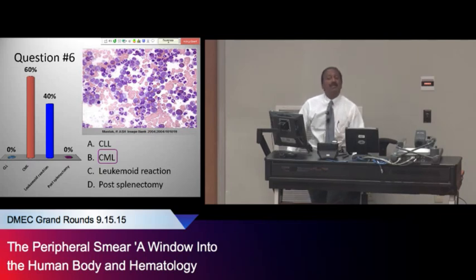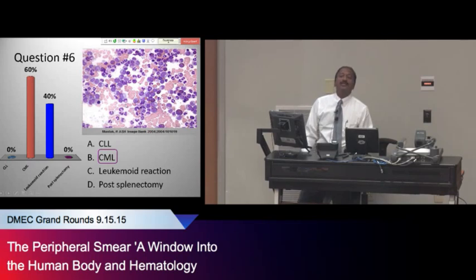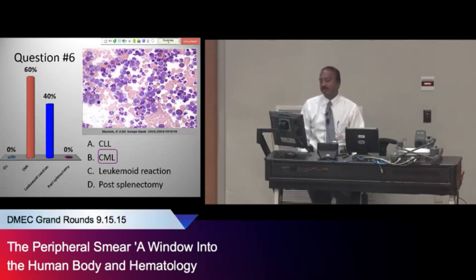Remember, people have been looking under the microscope at the blood for over 2 and 3 centuries. And this very same picture that's there in front of you, not maybe this slide set, was what 150 years ago John Bennett in England was looking at, and Virchow in Austria was looking at, and they gave the name leukemia. And that's how the term leukemia was coined, because they said, hey, that's a lot of white cells. These are leukocytes, and these are not red cells. And CML was diagnosed and a label given in the 1850s and 1860s. And that's the same peripheral smear that I'm seeing at the Regional Cancer Center today, 150 years later.